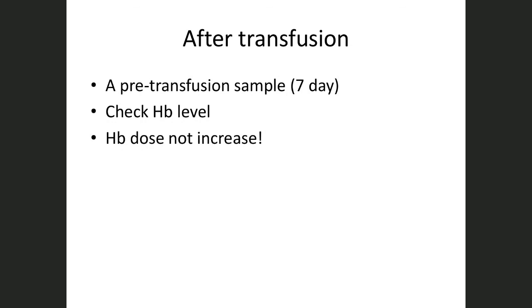So what procedure do we have to follow? We have to keep a pre-transfusion sample for at least 7 days.